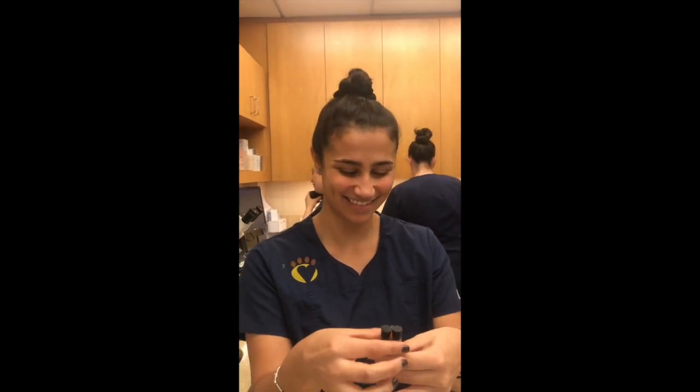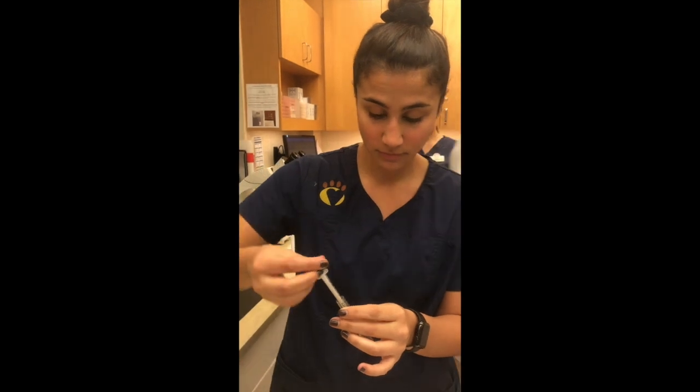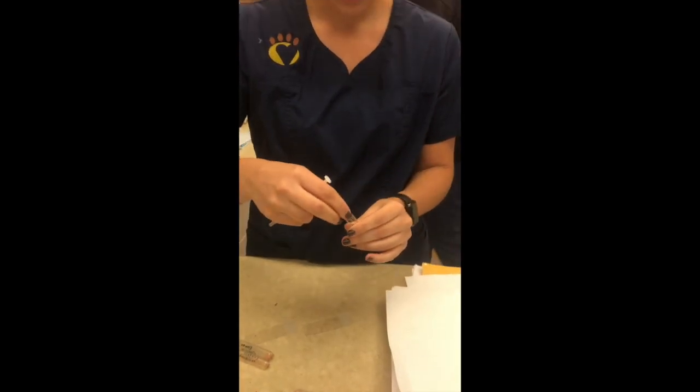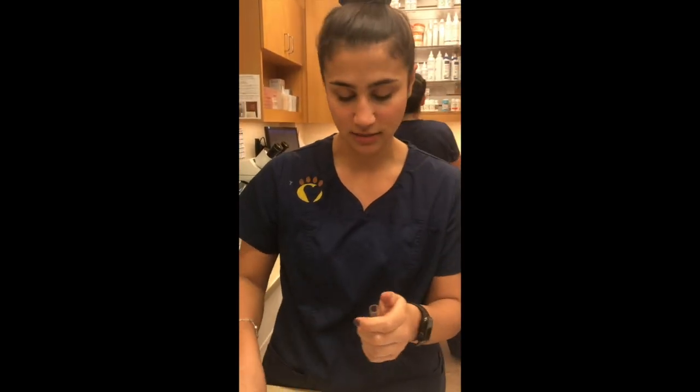Okay, so now I'm going to do a microscopic evaluation. First, I'm going to do our minor. So I'm just going to take a drop and put it on our slide. And then I'm going to take a drop of our major as well and put it on a different slide.